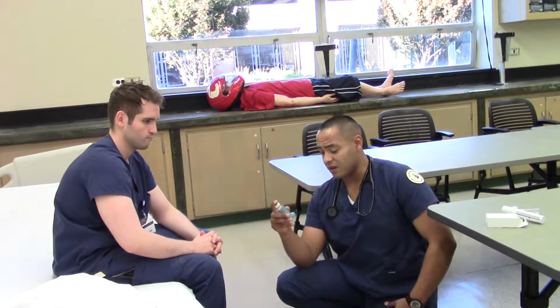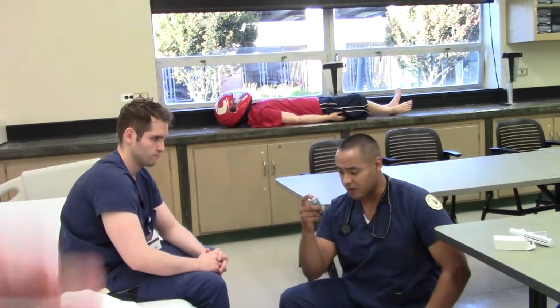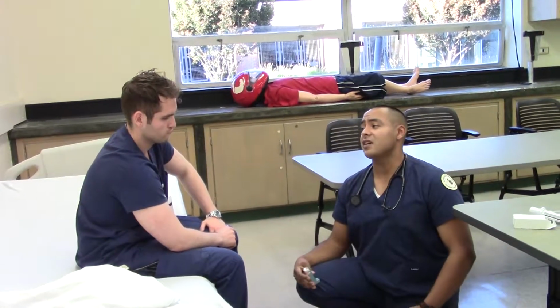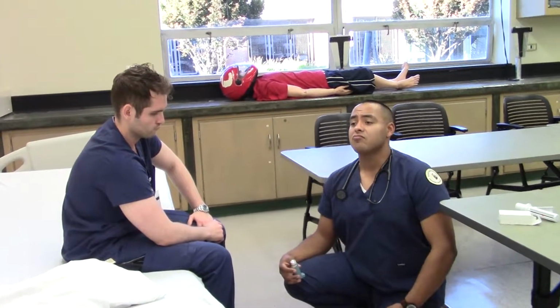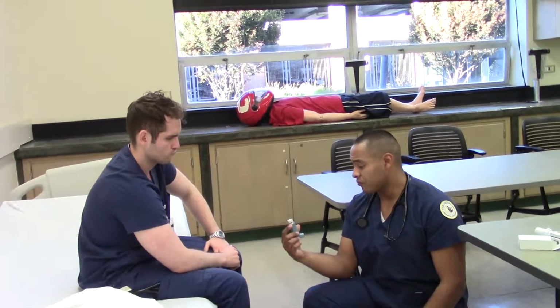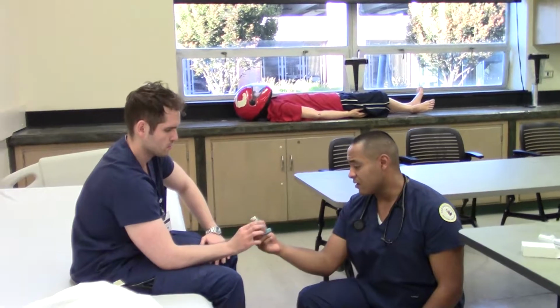So you breathe in here. You breathe. Go ahead and breathe out. Then once you breathe in, you push the button. You actuate it, and then you hold your breath for 10 seconds if you could. Then you breathe out through your nose. Okay, that's how you use it. Go ahead and give it a try.